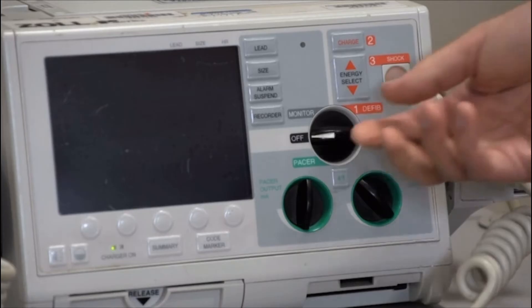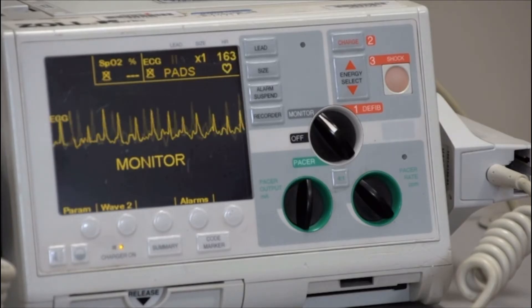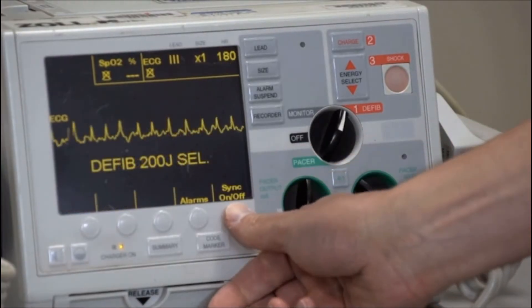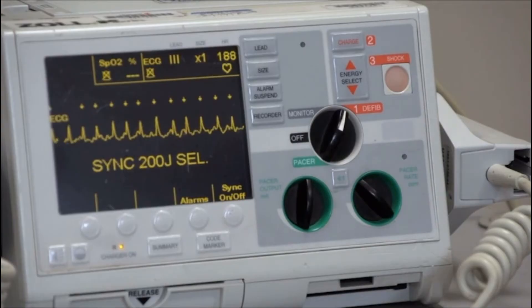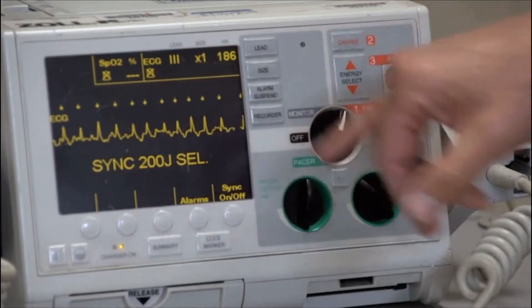Turn the machine on. Ensure the monitor is displaying a clear rhythm so that it may synchronize. If the rhythm is unclear, switch to a different lead on the monitor. Press the Sync button. This activates synchronization, which prevents a shock from being delivered during the cardiac repolarization phase, which can trigger ventricular fibrillation. Look at the monitor to confirm synchronization, which is usually indicated by a brightening of the peak of each QRS complex.